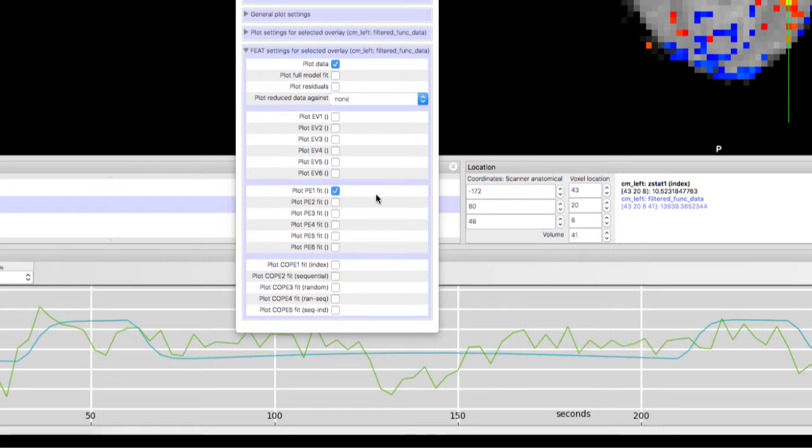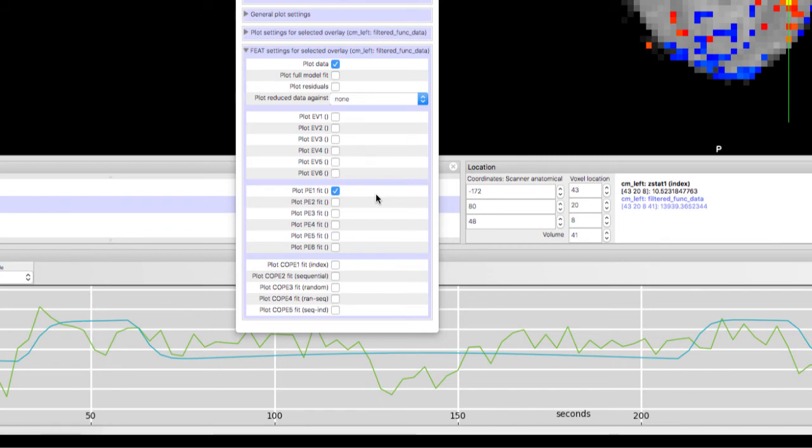These regressors, or PEs, are then used in a second level analysis to determine which voxels show consistently high or low parameter estimates. The larger the PE and the more consistent it is, the higher the T or Z statistic for that PE at that voxel.